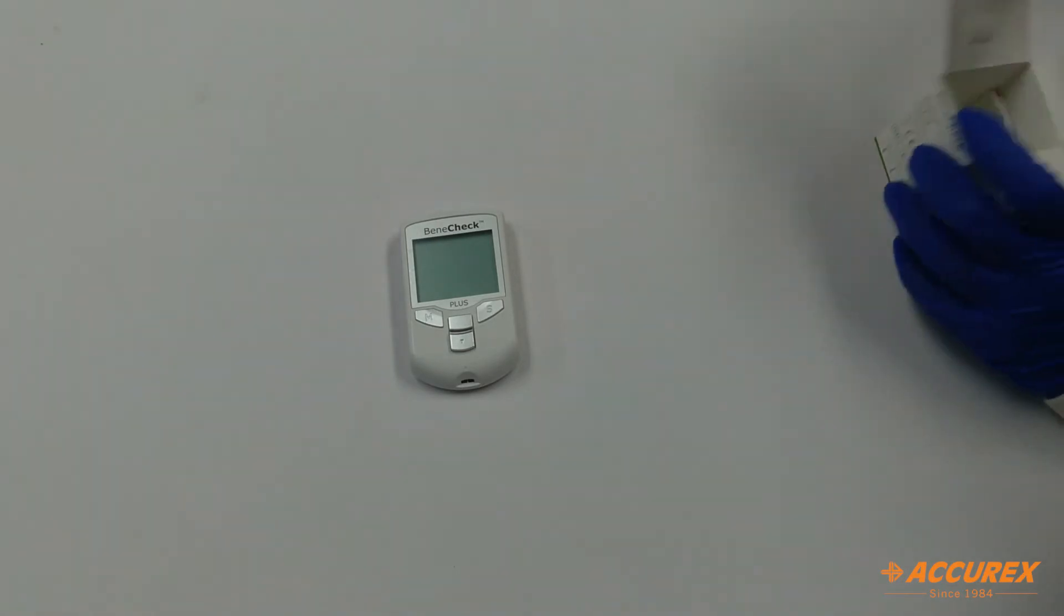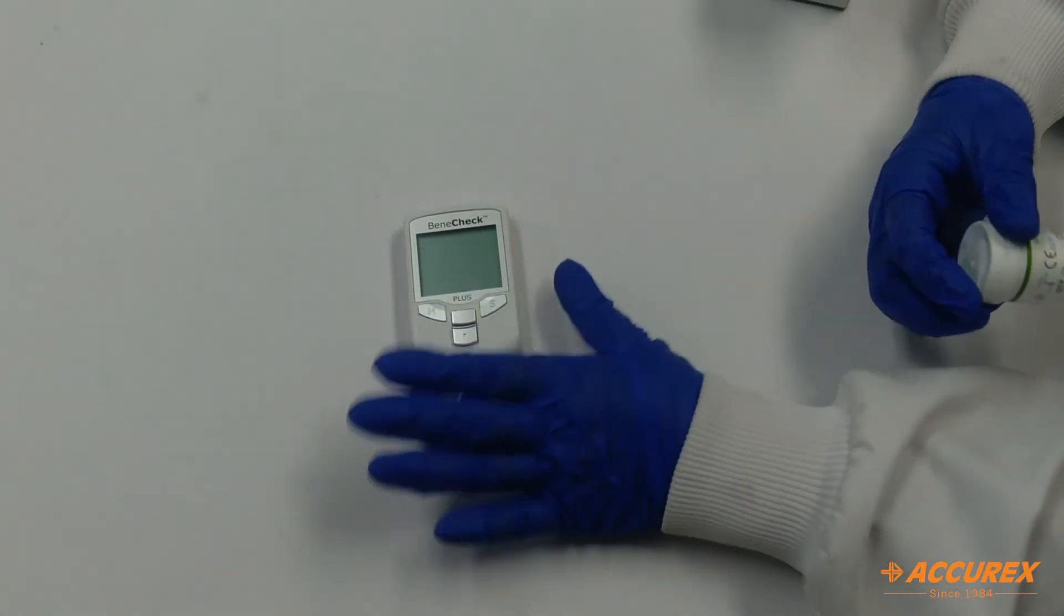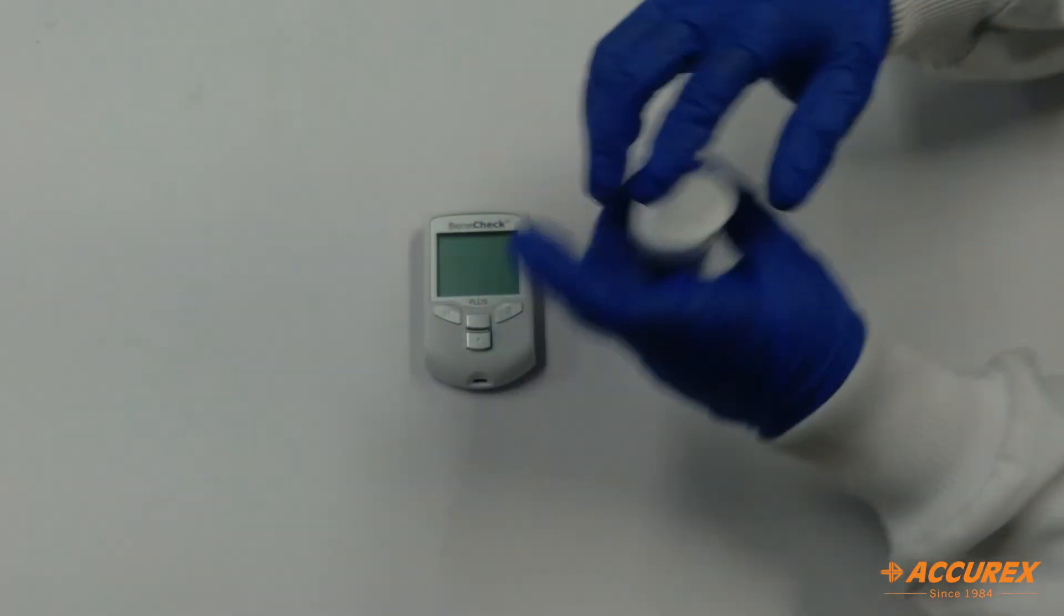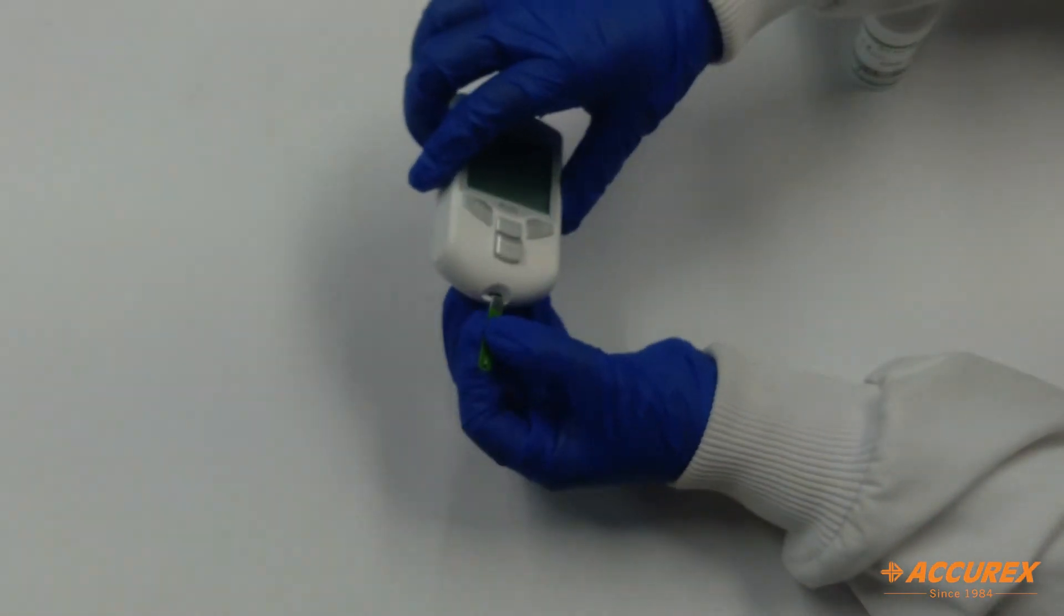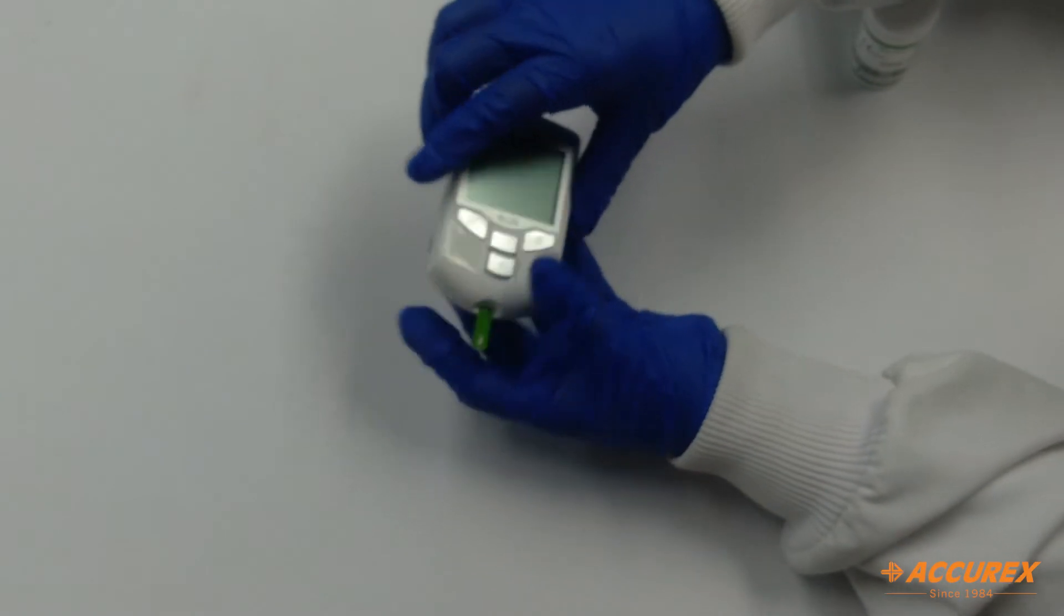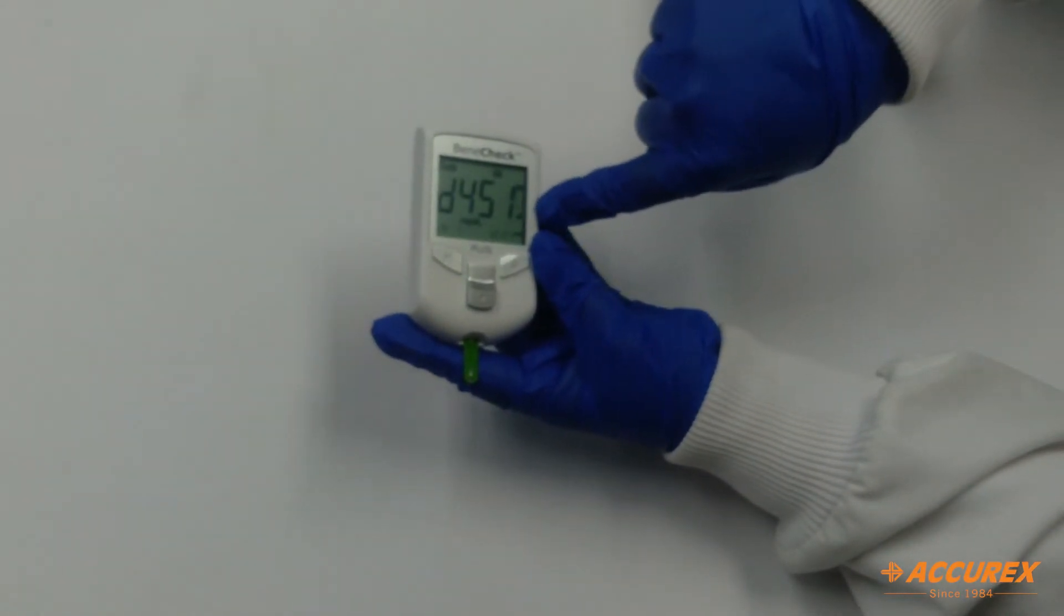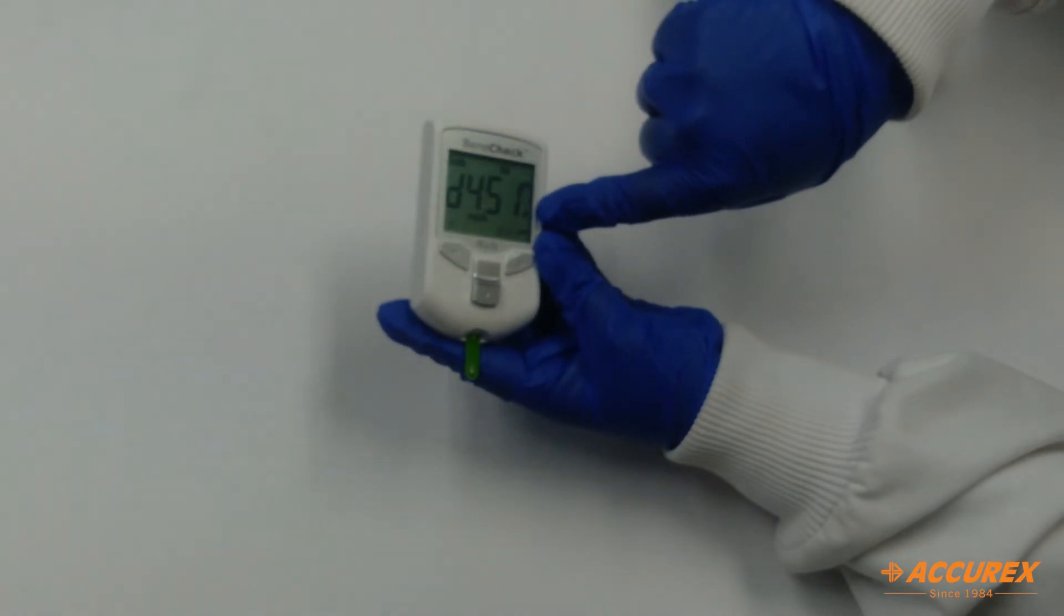When you remove the code chip the meter will switch off. As you insert the strip the meter will switch on. You will insert the strip like this and then it will prompt to put the blood sample.